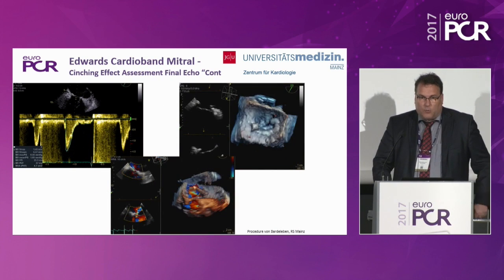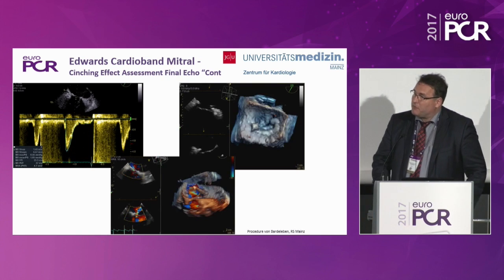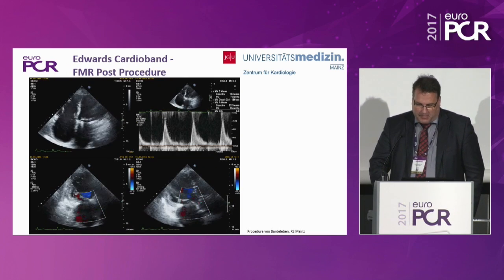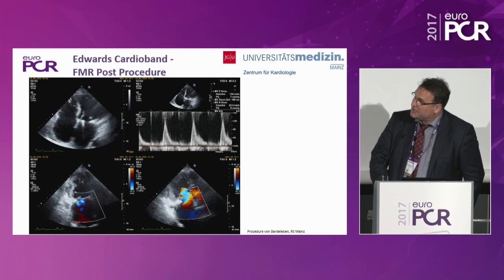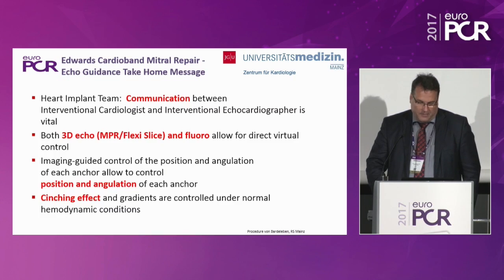One of the advantages of this system is that all further options are kept open, and using an annuloplasty, of course, you generate no stenoses. You see here that we have a mean gradient of 1.4 millimeters of mercury after successful reduction of the mitral regurgitation, and you see in this large atrium that there's a trace of residual regurgitation after the procedure. It's the same patient that you've seen before.